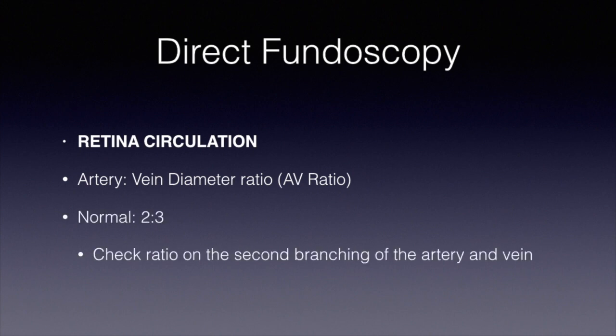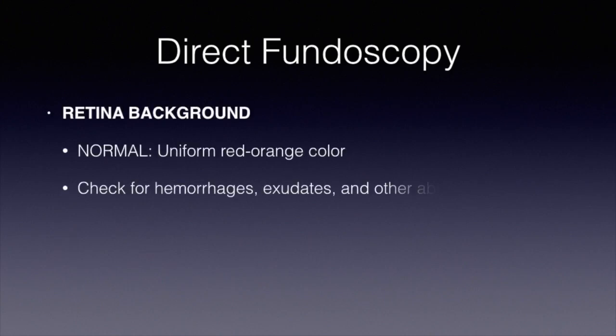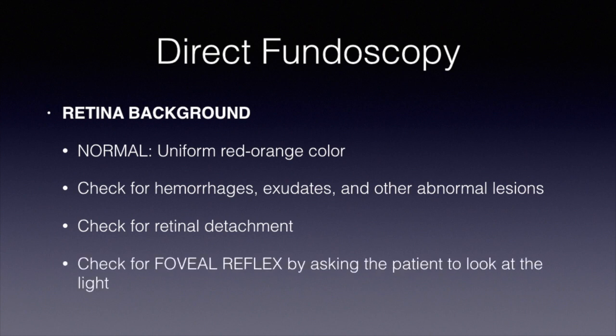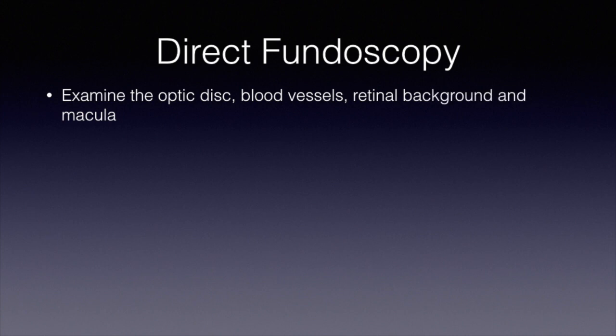The normal retinal background is red-orange in color with no hemorrhages or exudates. Check for retinal detachment and check the fovea light reflex by asking the patient to look at the light, which is reported as a good fovea light reflex. Again, remember how fundus findings are recorded.